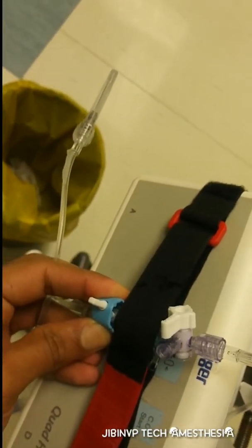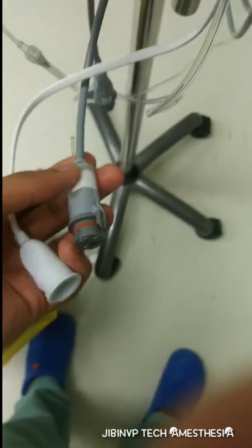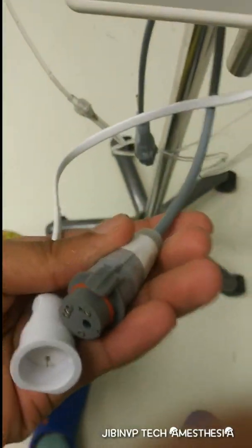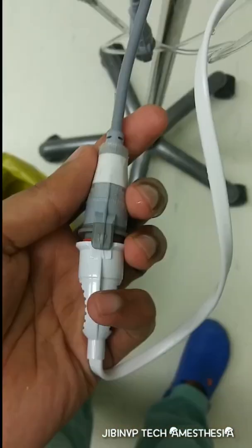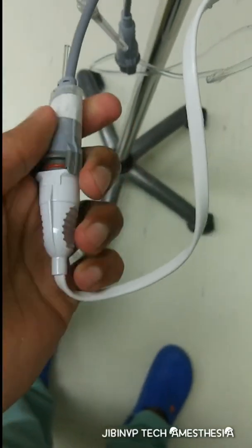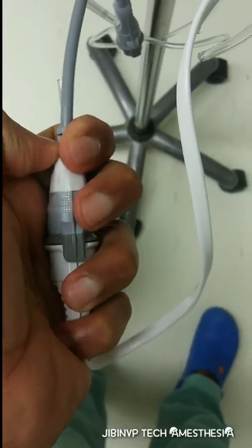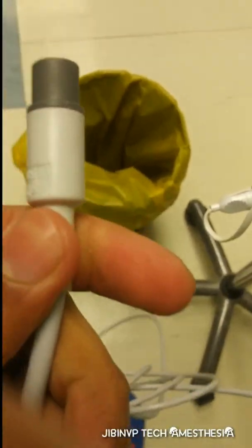After flushing — full flush out — it is kept ready for the patient end. Now connect this end to the transducer and tighten it securely, then connect this end to the monitor.